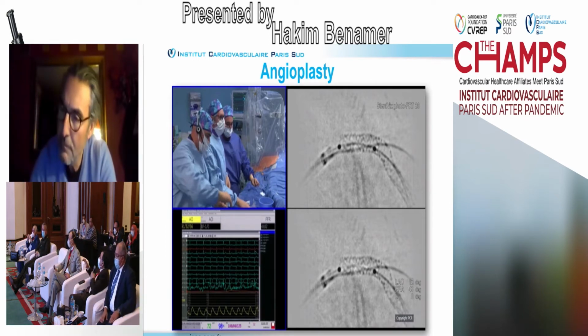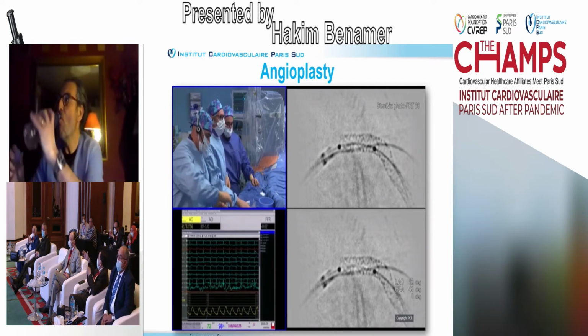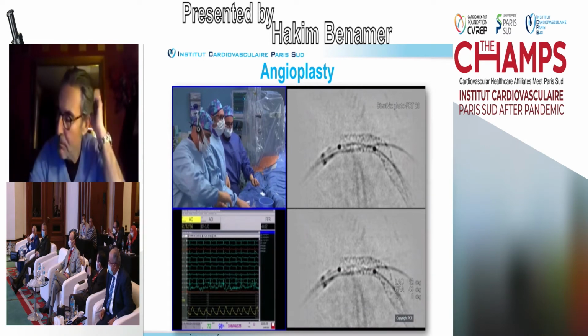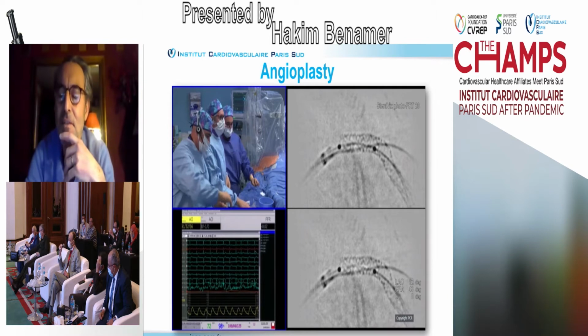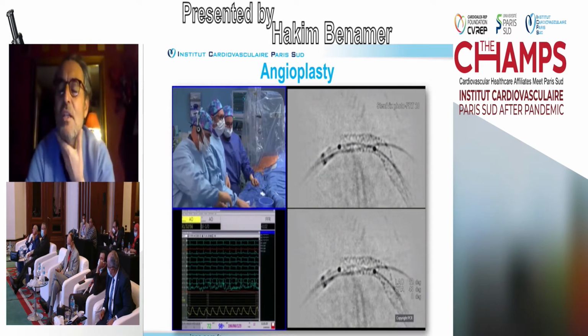In this case, 6 French you can manage because the ostia, or both ostia, are of small caliber. You're doing it with 6 French, yes, like myself. Okay. Dr. Nomani? I prefer 7 French. 7 gives more space for facilitation, manipulations. Okay, and I prefer 7 French. Dr. Sobhi. So we have 50% 7 and 50% 6. Hakim, if you have more than 2 wires, I like 7 French.